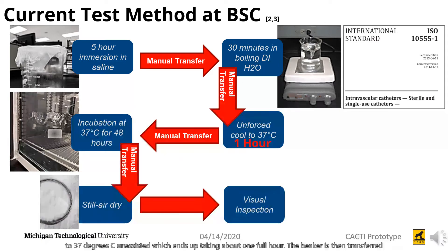The beaker is then transferred into an oven where it can be incubated at 37 degrees Celsius for 48 hours. Once the 48 hours is up, the beaker is removed and the sample is allowed to still-air dry until it can be visually inspected.